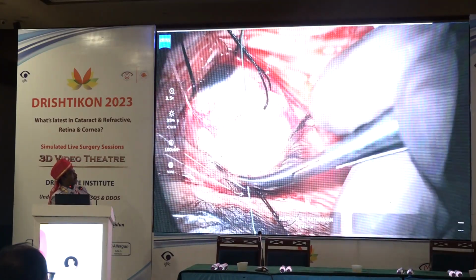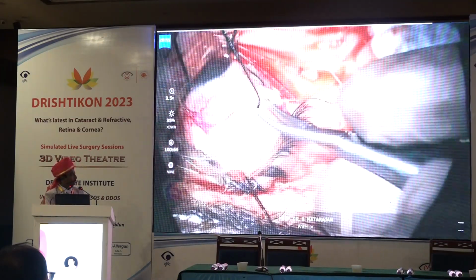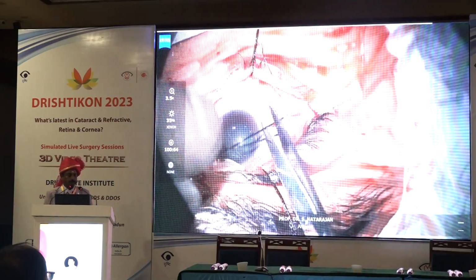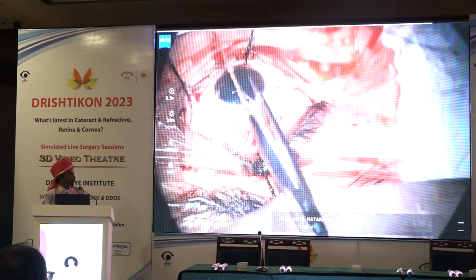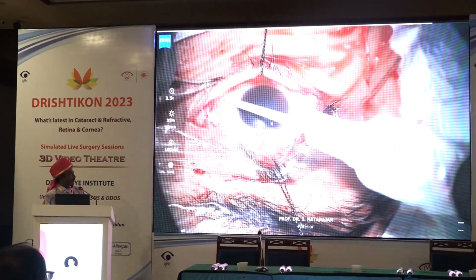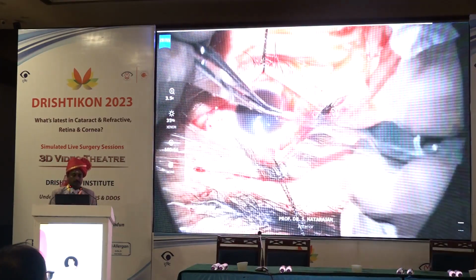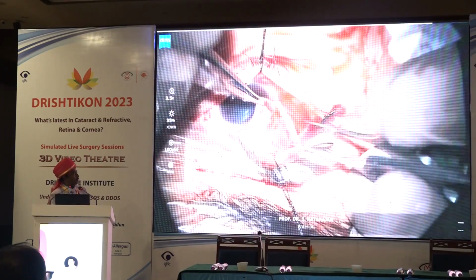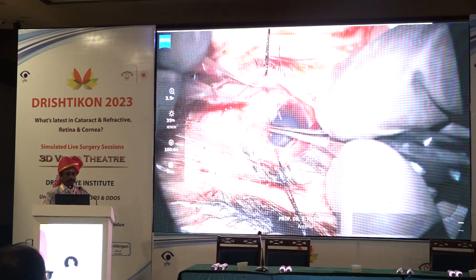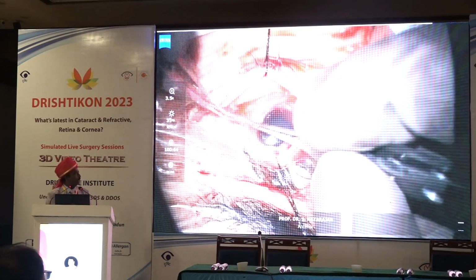As I said, the knot is exactly on the center of the buckle, so that it doesn't erode over the sclera or over the conjunctiva, and then the Tenon's covers well. I use only one suture for the buckle. Rest will not have any sutures, and I use the Reli seal. Sometime earlier we were using the imported one, which is expensive. So you can use the glue for closing the conjunctiva, so that the patient does not have to come for suture removal, or there's no irritation in the post-operative period.